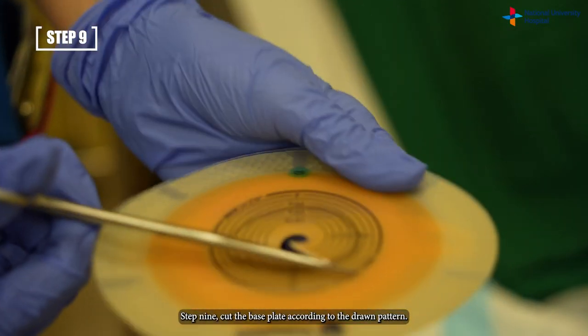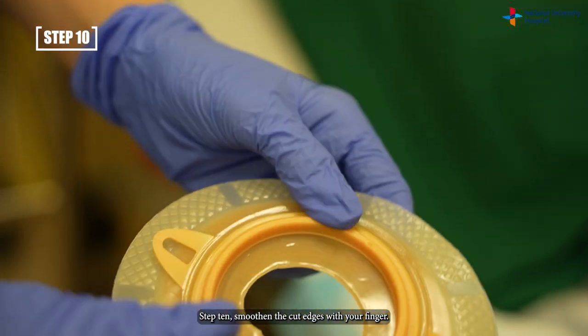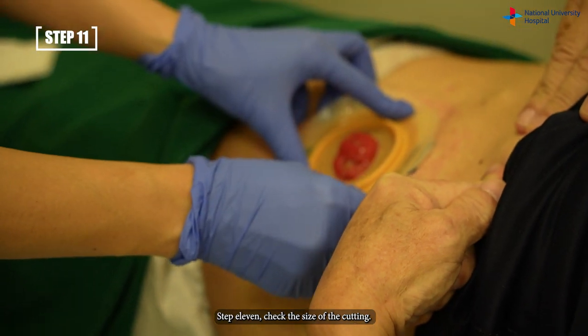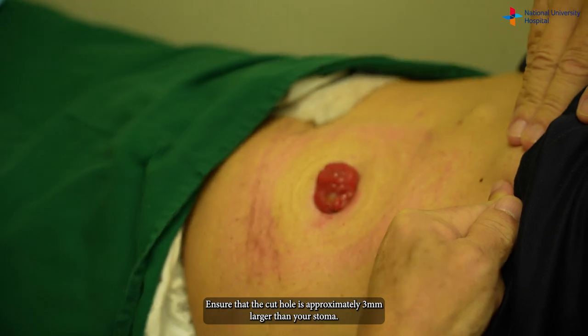Step nine: cut the base plate according to the drawn pattern. Step ten: smoothen the cut edges with your finger. Step eleven: check the size of the cutting. Ensure that the cut hole is approximately 3mm larger than your stoma.